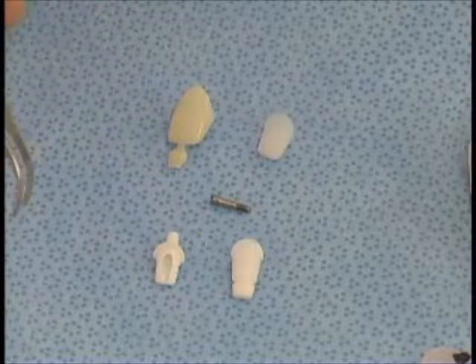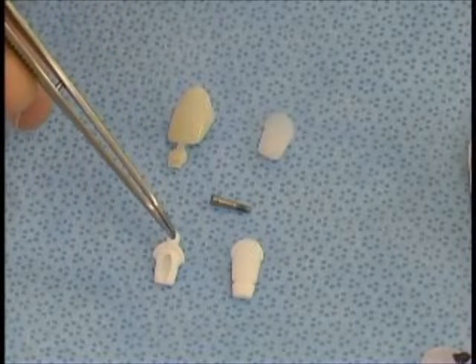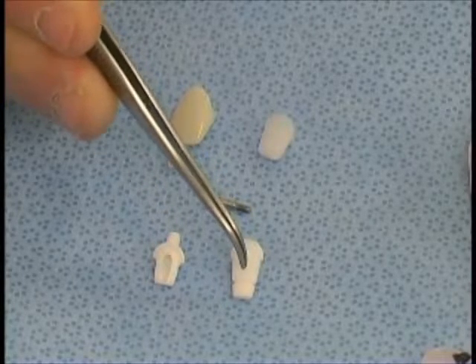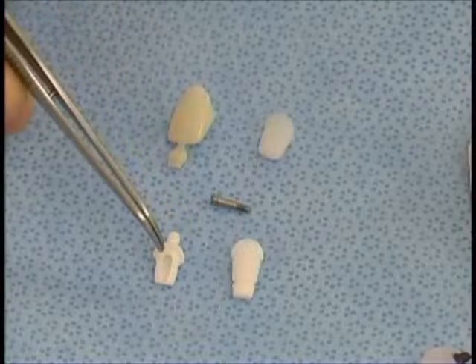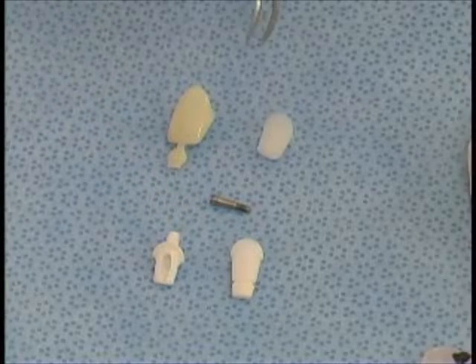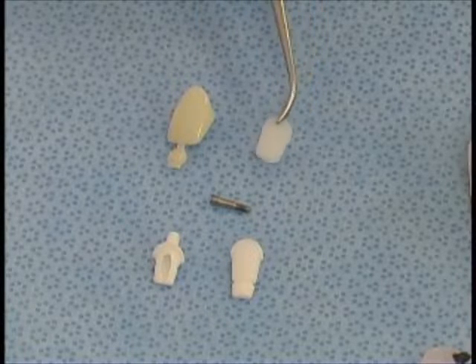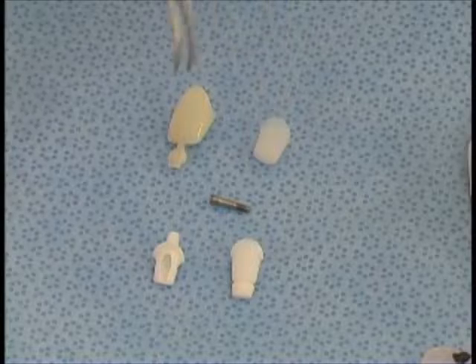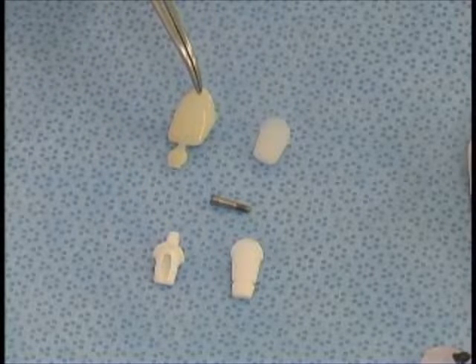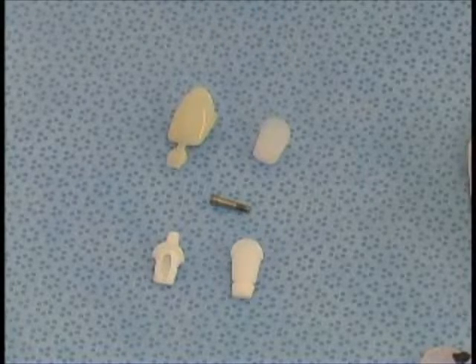Once the implant is put in, we will put in the abutment, which will actually stay with the patient, and we'll use the zirconium coping and retentive component to take an impression at the time of surgery. We also can utilize an acrylic coping that fits directly onto the abutment, and a standard polycarbonate crown to pick up the coping and make a temporary restoration that same day.